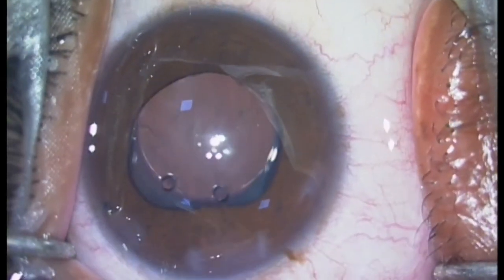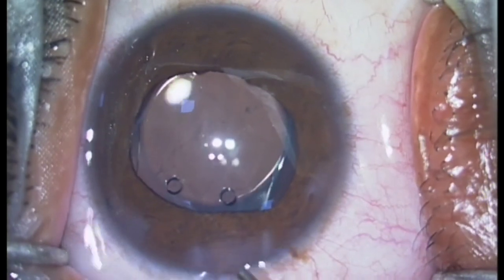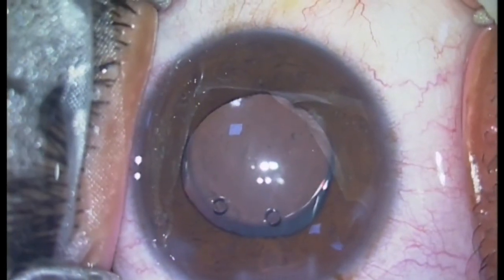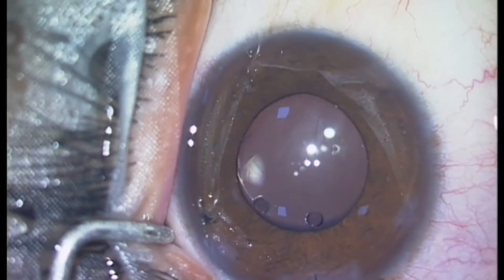Finally, the anterior chamber is formed with balanced salt solution and injection of intracameral preservative-free moxifloxacin eye drops. Thanks for joining us.